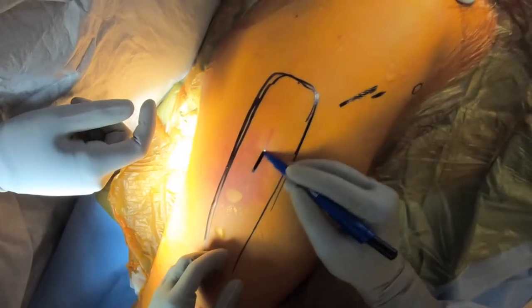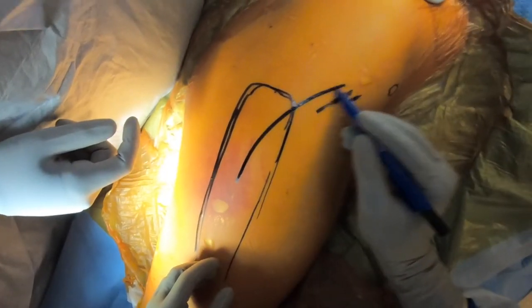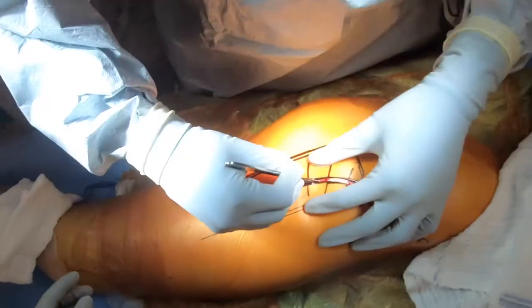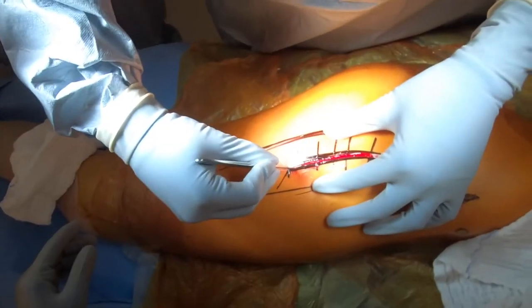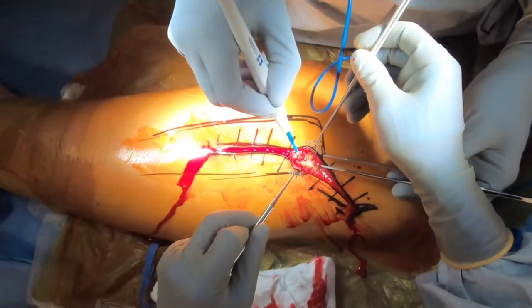The outline of the lateral femur is marked and a curvilinear incision is made centered over the anterior one-third aspect of the proximal femur, aiming towards the ASIS. Skin and subcutaneous tissues are sharply dissected with the scalpel. Hemostasis is obtained with bovie cautery.